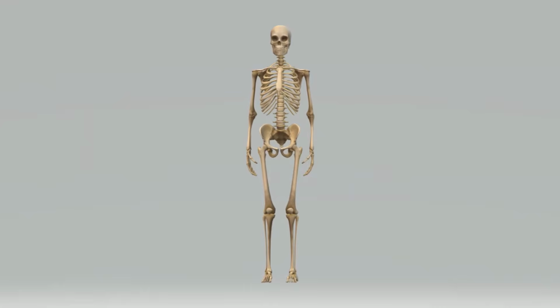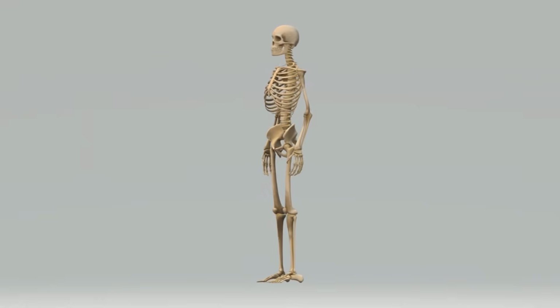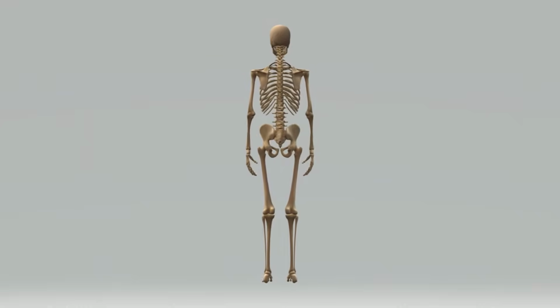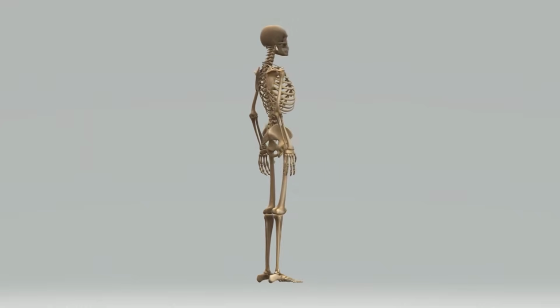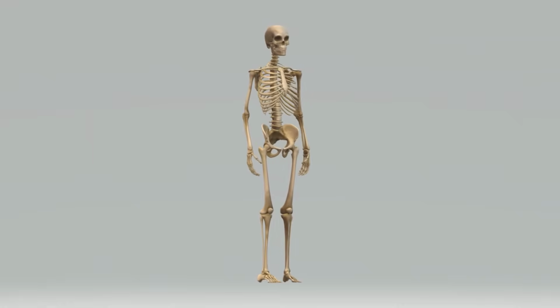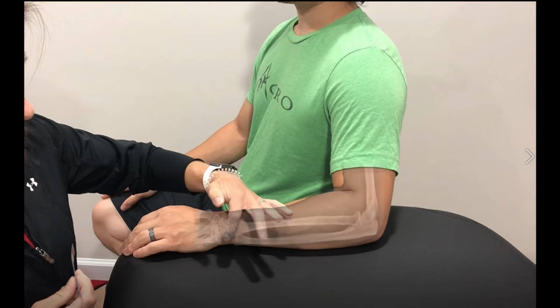Thorough knowledge of anatomy is key in physical therapy, and goniometry is no different. The ability to reliably measure joint motion is only as good as the ability to properly identify and palpate bony landmarks on the skeletal system. Before attempting goniometry, significant time should be spent on identifying and learning the proper bony landmarks used for alignment.